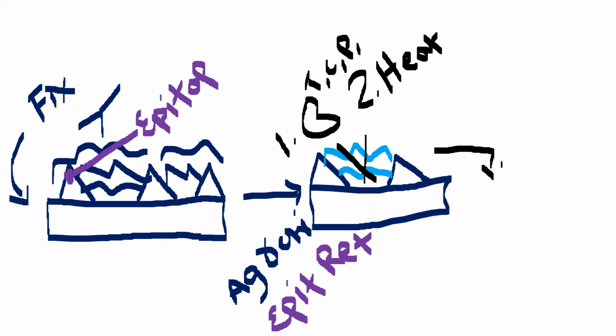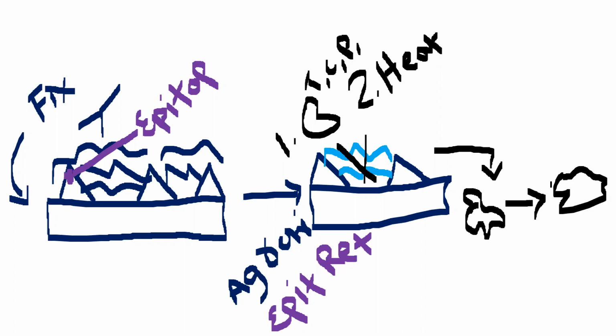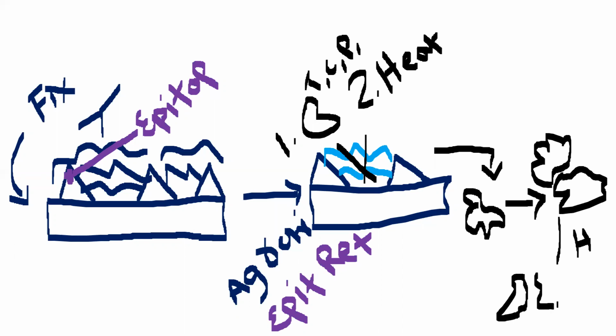That is why we have a very clever approach for this problem. Say, for example, this is a fixed protein, and the fixed protein has some crosslinks. Now I'm subjecting it to heat. Because of heat, the crosslinks become one part, and the protein becomes another part. But this protein is not in good shape. Now we have two parts.